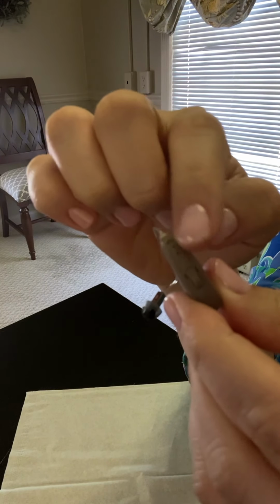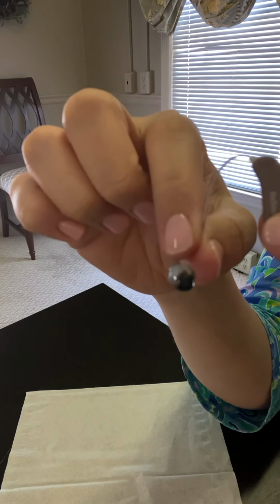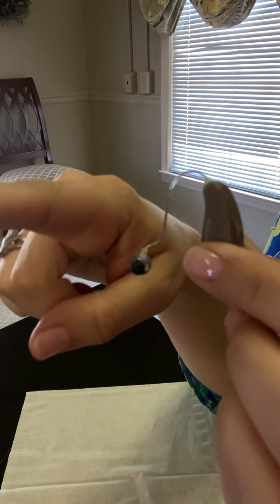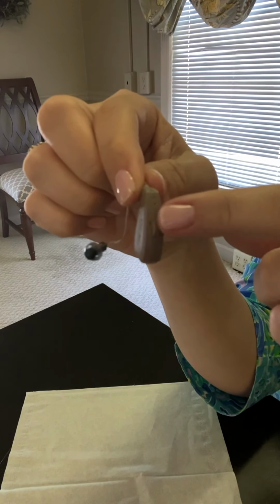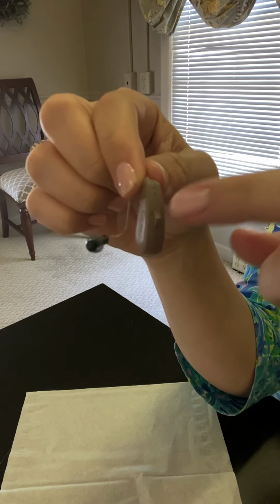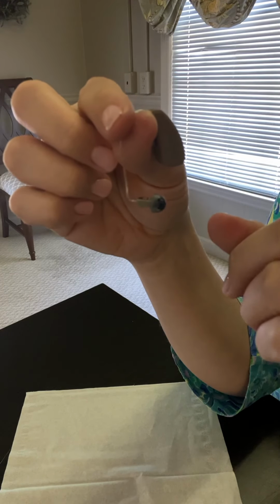Sound goes in through the microphones. The devices work their magic. It comes down this wire and then goes out into your ear through the speaker. If the microphones are clogged, sound cannot get into the hearing device. If the speaker's clogged, sound can't get out.